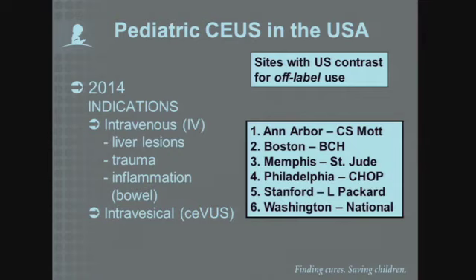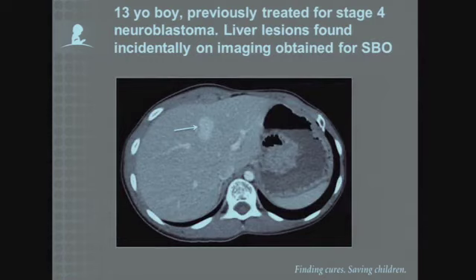And these sites are using the contrast agent for clinical indications for assessing liver lesions, trauma, and bowel inflammation, and also for intravesical use for contrast-enhanced voiding urography. I'm just going to show one example where we found contrast ultrasound to be extremely useful clinically.